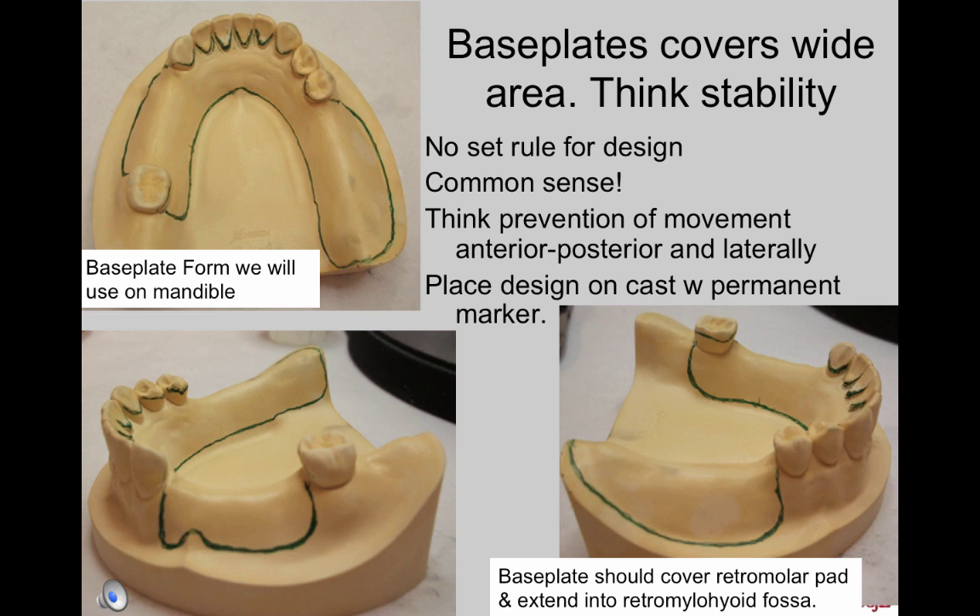Base plates should cover a wide area of the arch for stability and support. There is no set rule for design, but think about where the base plate should touch to prevent movement anteroposteriorly and laterally. On an extension base side, it should cover the retromolar pad and extend into the retromylohyoid fossa for retention. They should not move when taking a jaw registration. Place the design on the cast with a permanent marker — not a lead pencil, as it will get into the record base material and give it a dirty finish. Soak the cast before beginning, and you may place a very thin layer of Vaseline on the cast as a separating medium, though it isn't necessary if you keep the cast wet.